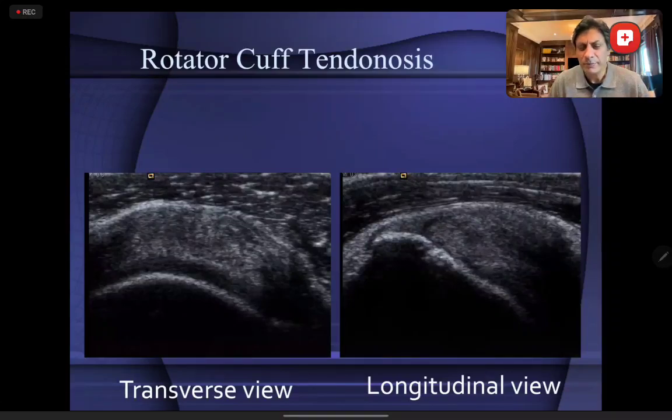Ultrasound is very good for picking up rotator cuff problems, as we discussed when we were back in Quetta, and I showed you some figures as to which is better. Actually, MR and ultrasound are pretty much the same. So if somebody asks you in a Viva, they have the same sensitivity and specificity for picking up partial and full thickness tears in the rotator cuff, provided, of course, you're trained. In other words, you regularly do ultrasound of the shoulders.